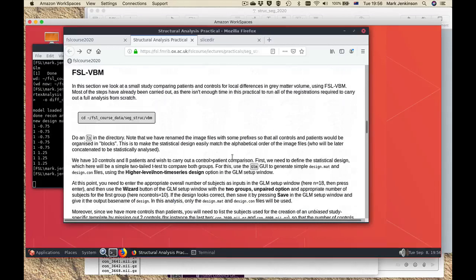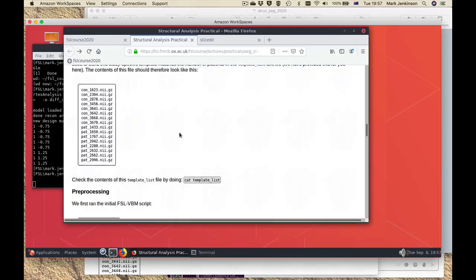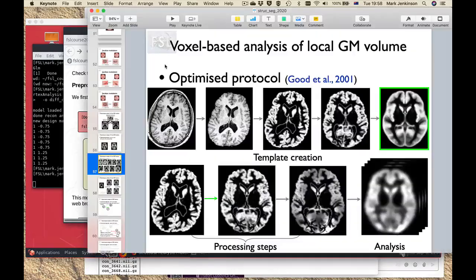The next section is on VBM, or voxel-based morphometry. This takes a lot longer to actually run because the pipeline has to do a lot more things, so in this section of the practical most things have already been run for you. You'll be largely looking at results but it will show you what commands were used to get to those results, so if you had your own data you could go through that process. It talks about what images go into making the template and there are a series of steps in red boxes showing what would have been necessary to run from scratch. Each of these sections maps onto part of the pipeline described in the lecture.